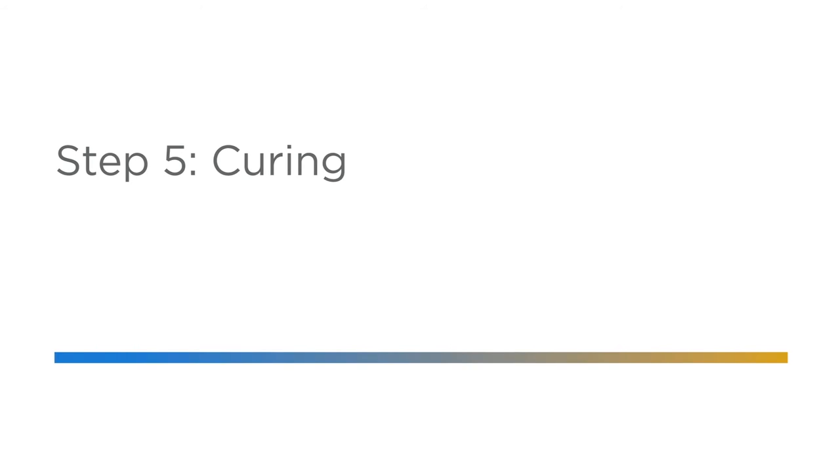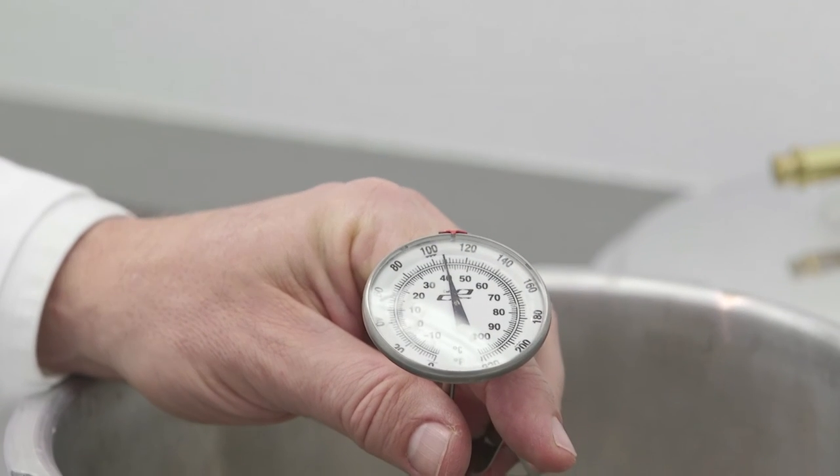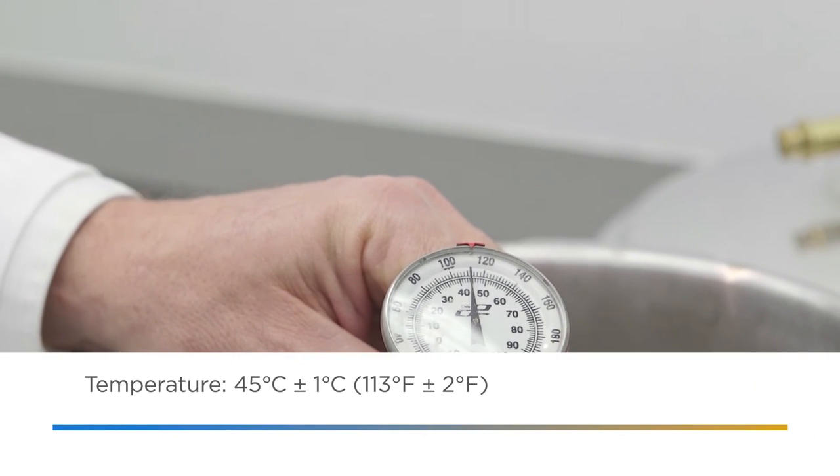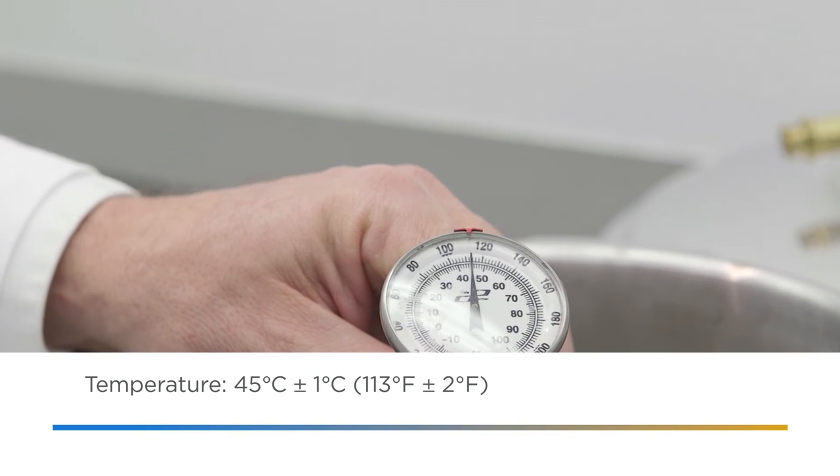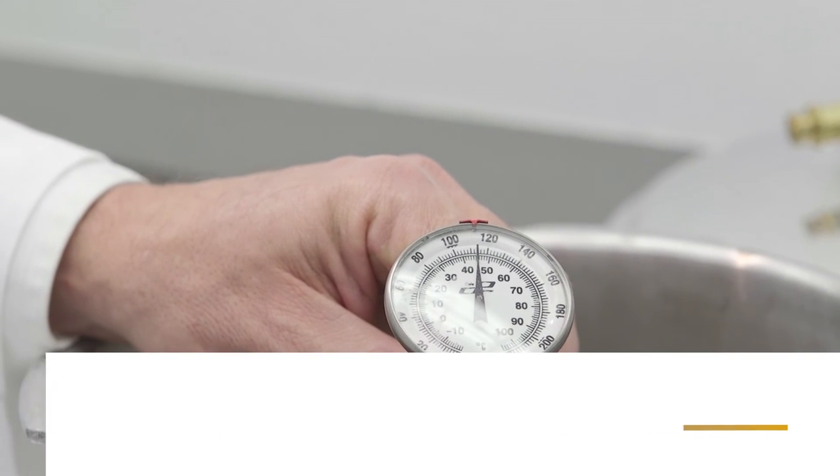Step 5 is curing. First, using an accurate thermometer, check the water temperature in the pressure pot and adjust to 45 degrees Celsius plus or minus 1 degree Celsius or 113 degrees Fahrenheit plus or minus 2 degrees Fahrenheit.